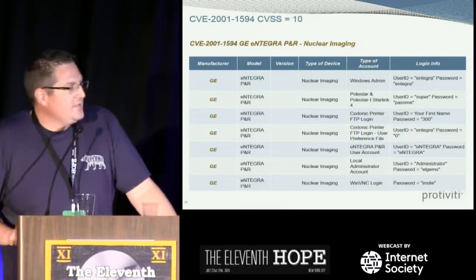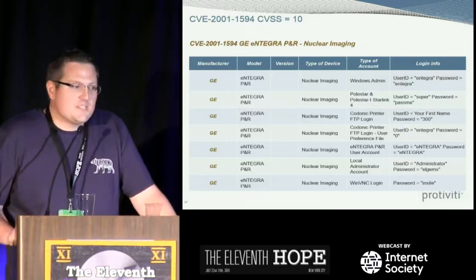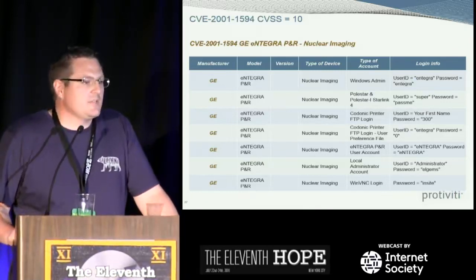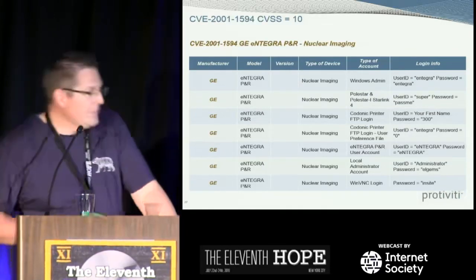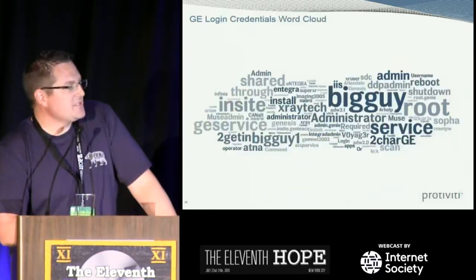So here you go, down at the bottom, this one's awesome. You see this a lot, like these WinVNC logins or PC Anywhere logins. Again, the intended use is to be able to support that system, but real poor practice and really weak passwords on those systems.